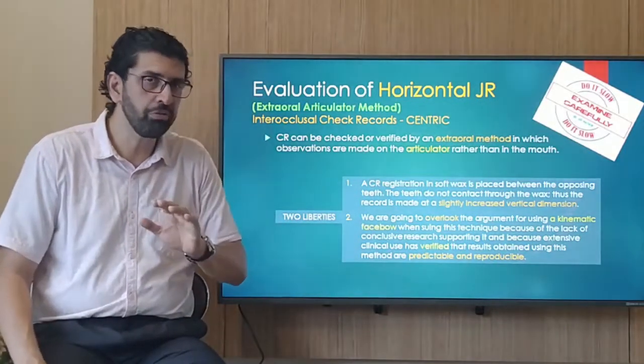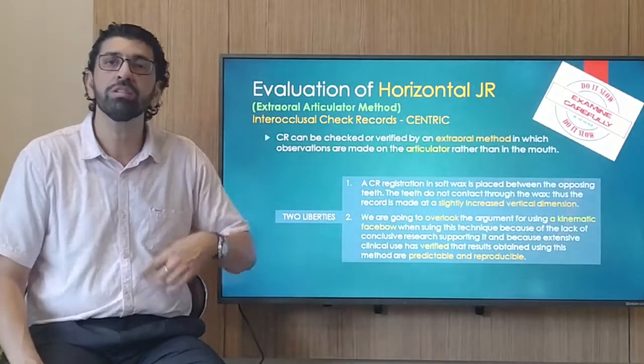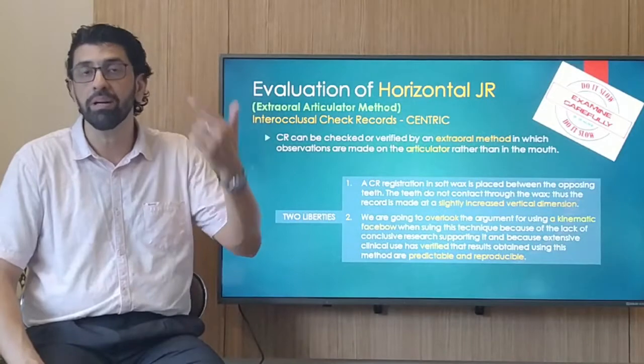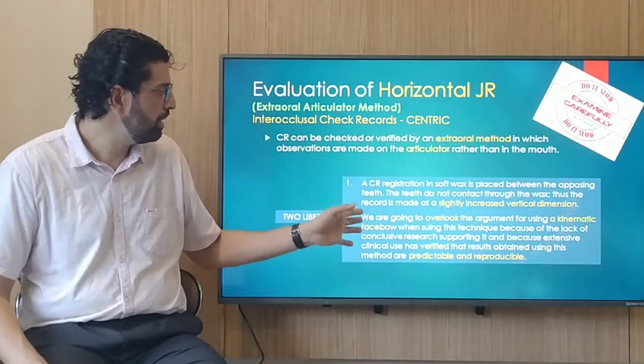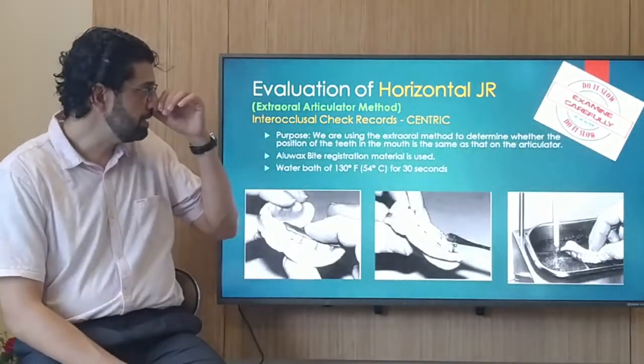Yes and no, because we're going to overlook that argument primarily because there's no conclusive evidence saying that is the state of affairs. Number two, because clinical practice over the years has proven that this gives repeatable and predictable results. For this reason, we're just going to go ahead and take this liberty and do this step.